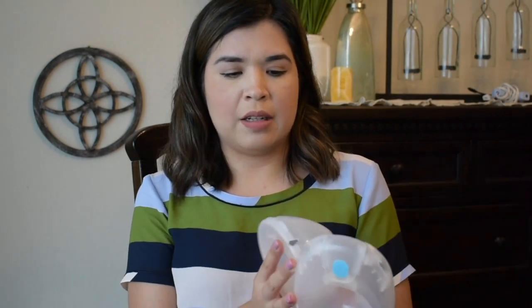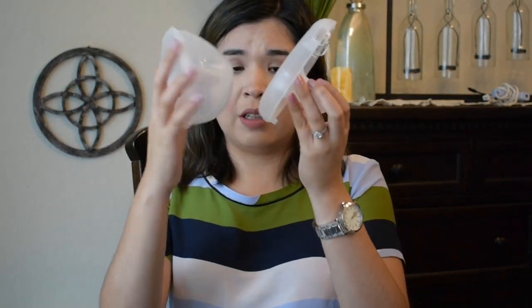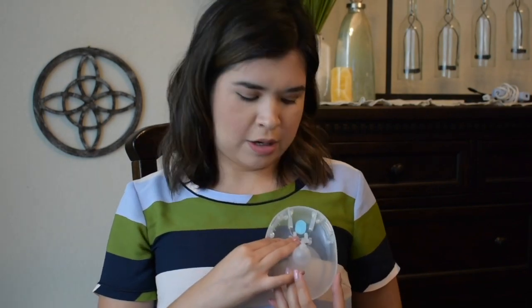Keep practicing — practice without the pump attached to it. I know a lot of people give advice to latch by aligning the top of the flange opening with the top of your nipple and then come down. I like to go the opposite way: align the bottom of the opening with the bottom of your nipple and come up. That was the best for me, and also try to memorize where you place the flange.